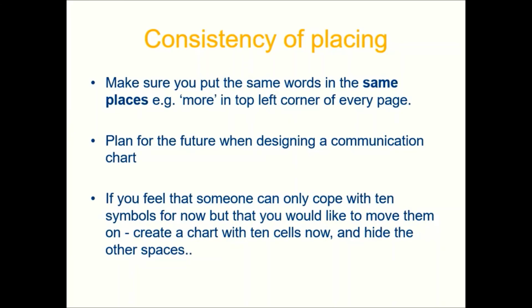So just thinking about the layout of a communication book, if you've got lots of pages, it can be really helpful to make sure that the keywords stay in the same place on each page. So identify a handful of important words that are probably going to be needed in every scenario, such as, I don't know, pain or finished, more, stop, like, don't like, and just make sure they're in the same position on every page. It just helps with navigation.